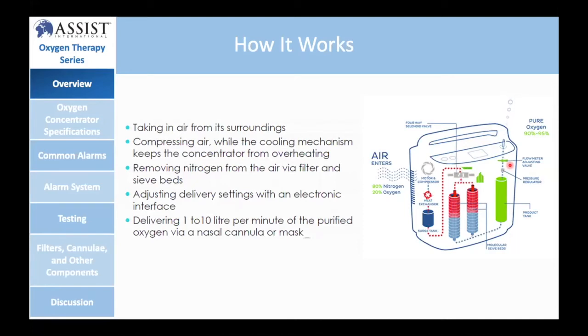And then that's connected to the patient via, it could be a nasal cannula or a face mask, which I believe are discussed already in the previous slide. So this is how an oxygen concentrator works. And of course, all these things are managed and controlled by a processor. So the oxygen concentrator comes with a central processing unit as well.